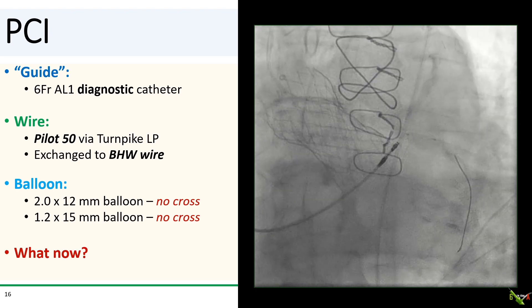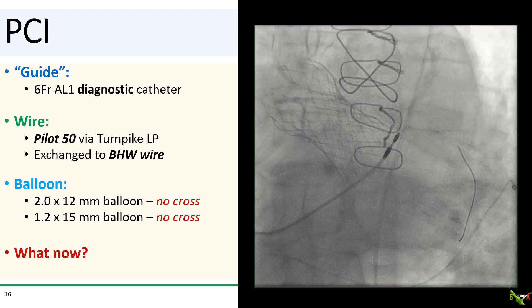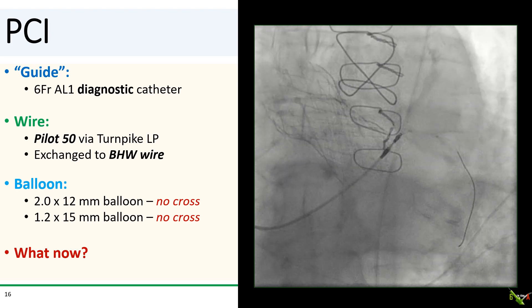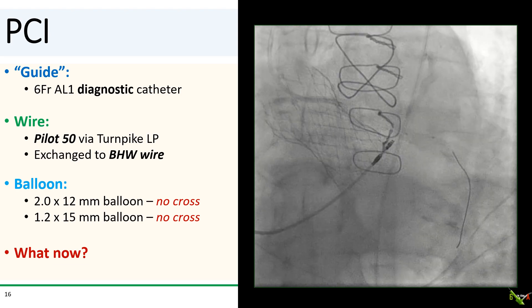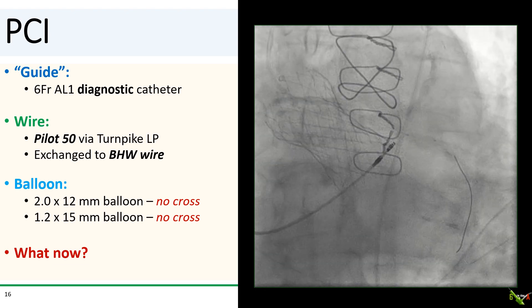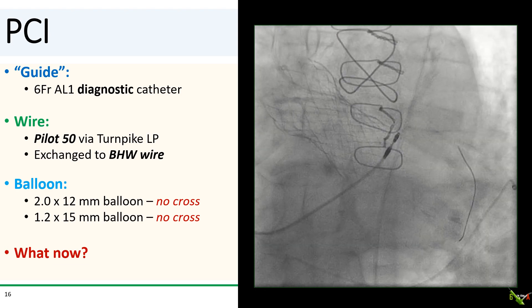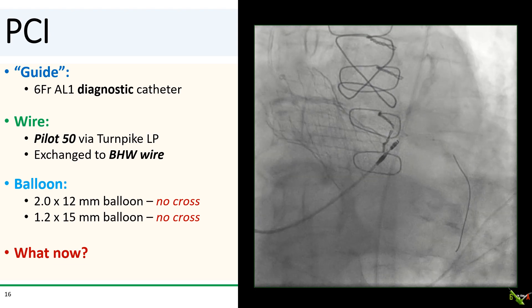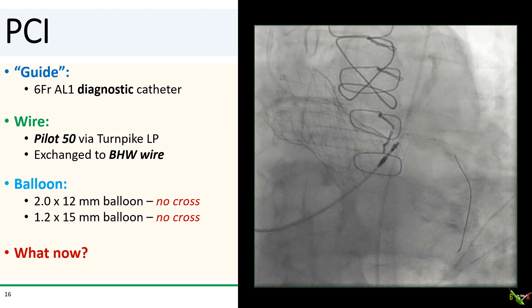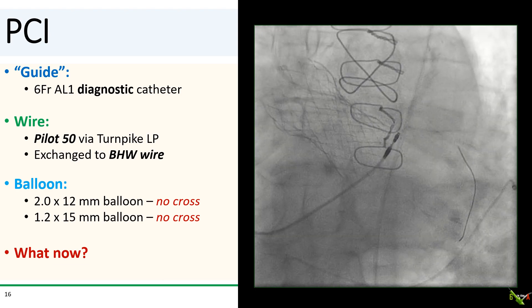We then attempted to pass a 2.0 by 12 mm balloon, but unfortunately that did not cross the lesion—this image is basically as far as it went. We tried a 1.2 mm balloon, and that couldn't cross either. The stenosis was very tight and there was a bend in the vessel, and backup from our diagnostic catheter was basically non-existent.